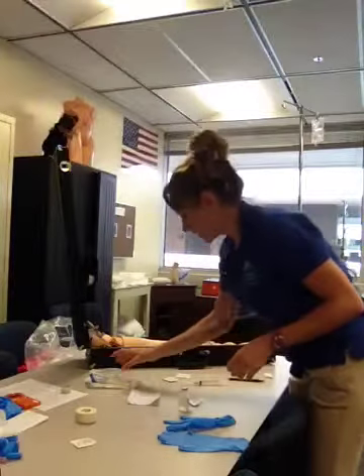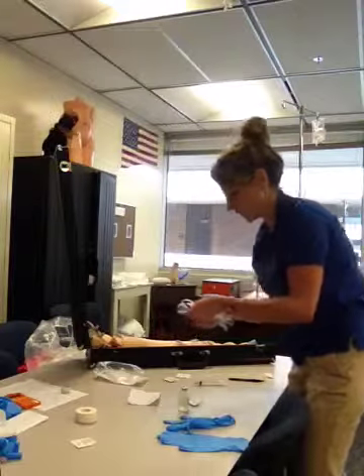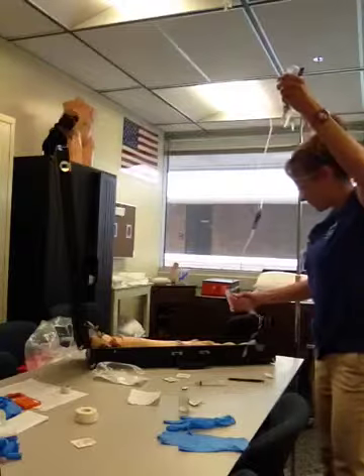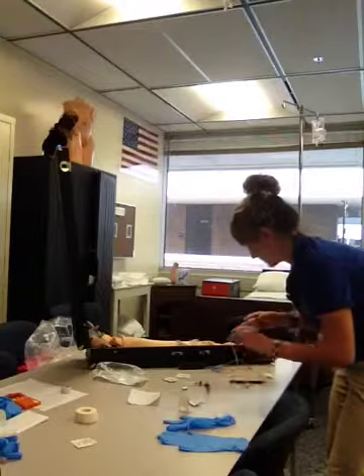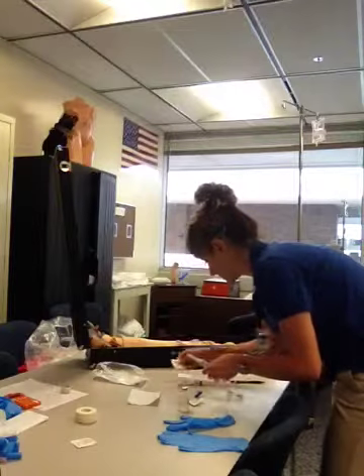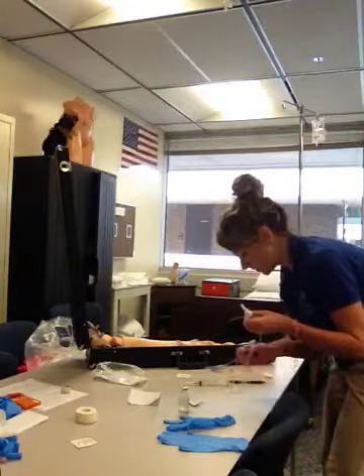Okay, next, I'm going to get out my tubing. Closed now.